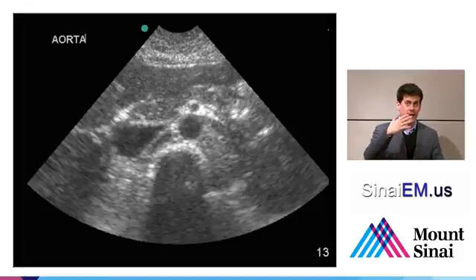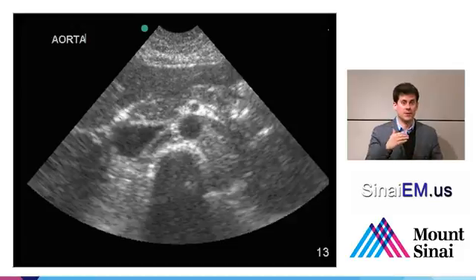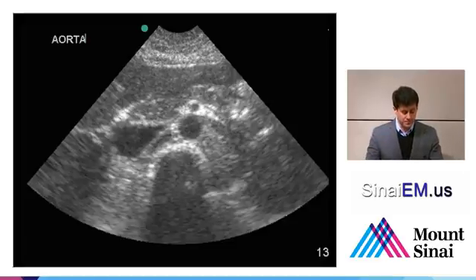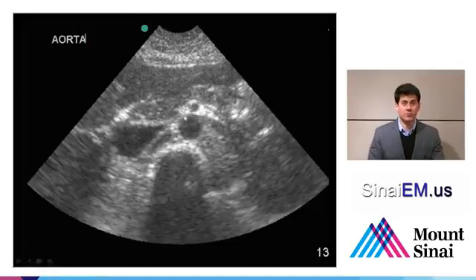So just like my hand will cast the shadow from the light, the ultrasound beam strikes the vertebral body, which casts a shadow sonographically behind it. So that leads to a slightly different appearance because this crescent shape is really only the anterior portion of the visualized vertebral body. Just anterior to that, we see the abdominal aorta, and just to the patient's right of that, we see the inferior vena cava with a bit more of an almond shape, a bit flatter.